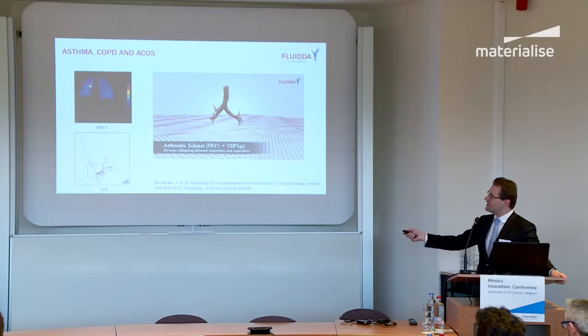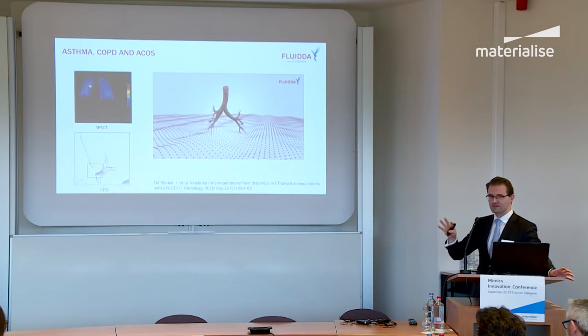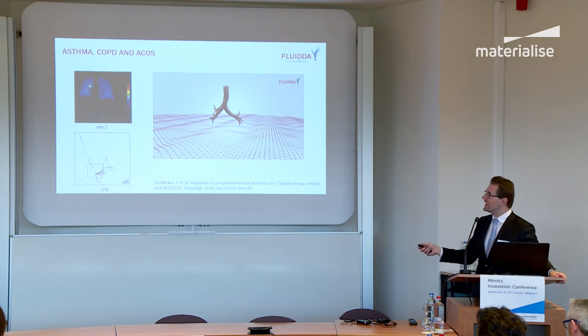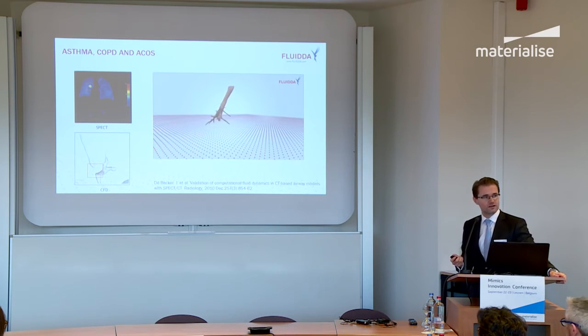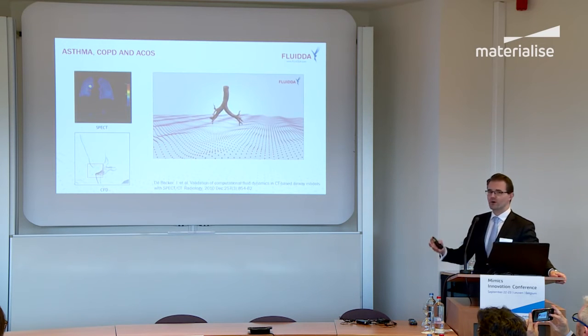And does it matter? It matters a lot, because mild asthmatic patients, we typically treat with these inhalers. But if you have very collapsible airways, what actually happens if you use an inhaler, you actually have hotspot formation. So all the medication is pretty much concentrated in certain discrete zones. So you will have chronically undertreated areas in the lung. So what's now a mild asthmatic patient will very rapidly become a more moderate or severe patient. So it is important to know what actually happens. Regional information in respiratory matters a lot.